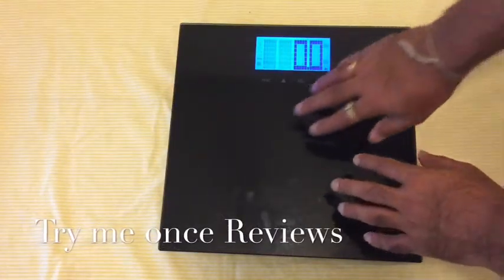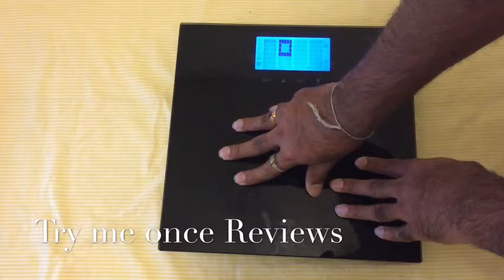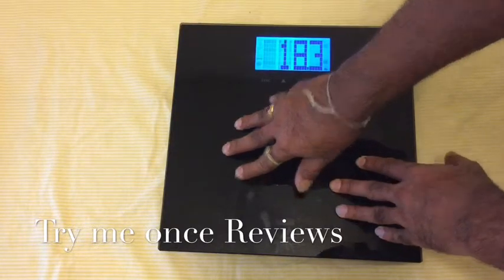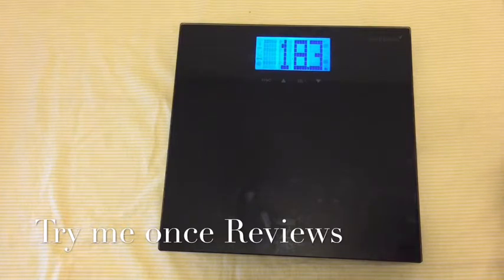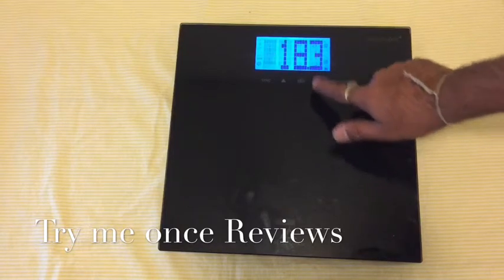I'm putting it on a table, that's why it's showing a reading — I'm applying some pressure here. It takes some time measuring the weight, and I think that's why it's more accurate. Other weighing scales I've used show weight pretty quickly but the weight fluctuates. This one is different — the weight stays the same and doesn't fluctuate.